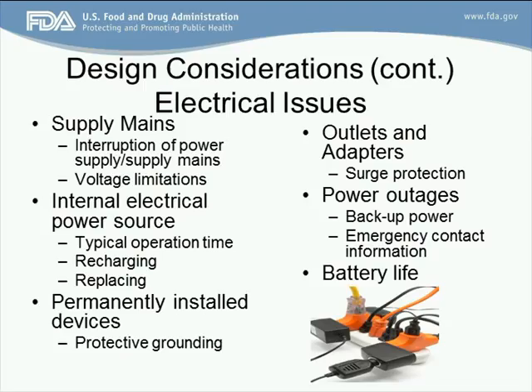What is the internal electrical power source, and what is the typical operation time? Does it need recharging? And if it needs recharging, is there any time where you have to replace anything? There are permanently installed devices that need protective grounding. I think of hemodialysis here, where they do need to have protective grounding with these permanently installed devices.